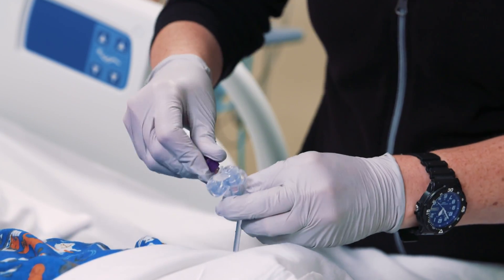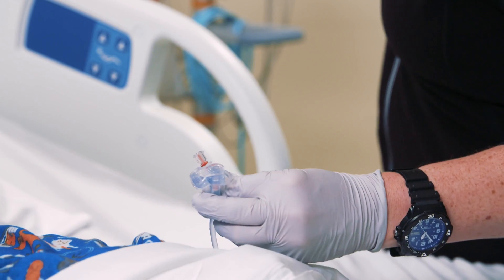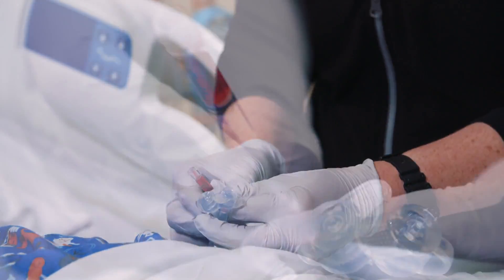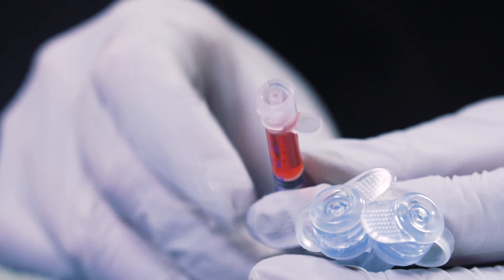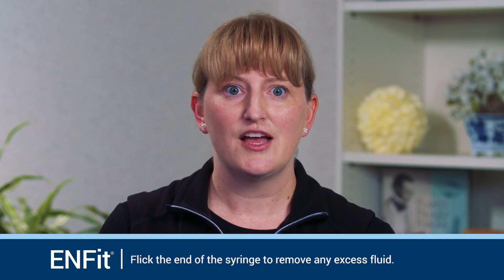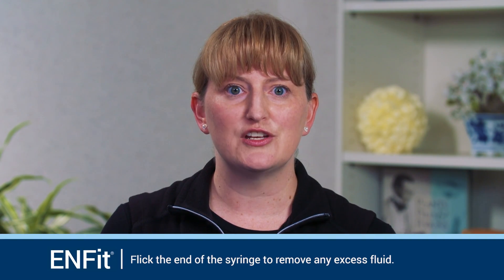It is important to note that the portion of the extension tubing that attaches to the patient's low profile device will not change. At this point, verify that the end of the extension set where the syringe is attached is an NFIT connector. Then verify that the syringe moat is free of excess medication. If there is excess, flick or tap the end of the syringe to remove.